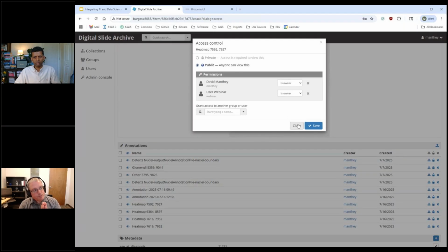Part of this is when you have a project that has multiple pathologists, you might want each pathologist to annotate something and then see if they're in agreement, or you might want them to collaborate, and those are very different use cases. If you want to see if they're in agreement, you don't want to pollute the data, so you want each person to have their own copy and only see their data and not the other person's. If they're collaborating, you say, I'm going to mark this up, and then can you correct anything you see that's wrong? And then I can look at your history of how it changed and see whether I should have learned from this. So the permissions control is intended to be as granular as needed, and can be quite complicated.